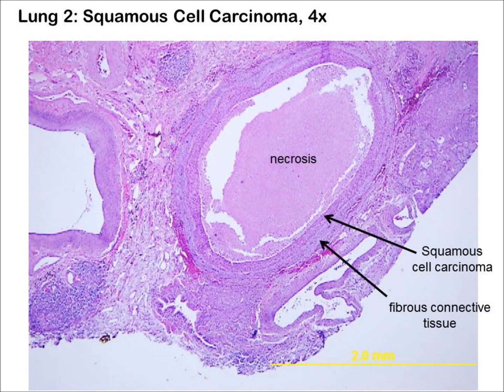Examine the central tumor mass in the larger fragment. Note that it consists of a highly convoluted mixture of both tumor cells and connective tissue. The boundary between these two is very sharp. The connective tissue contains fibroblasts, collagen fibers, adipose tissue, lymphocytes, and smooth muscle cells. Many of the tumor masses contain central necrotic regions in which the nuclei are condensed and fragmented.